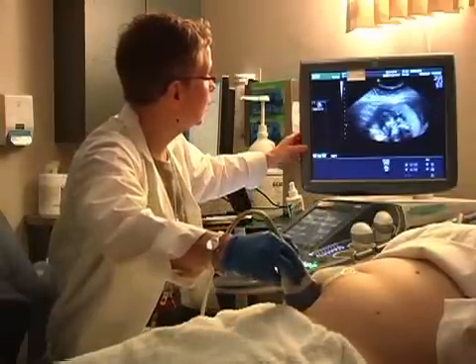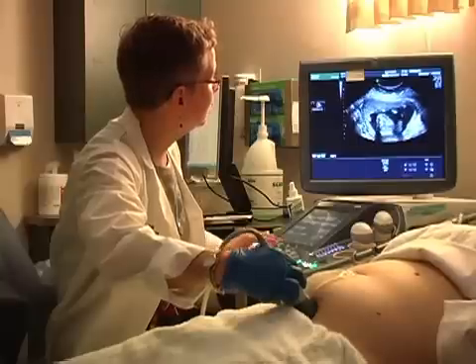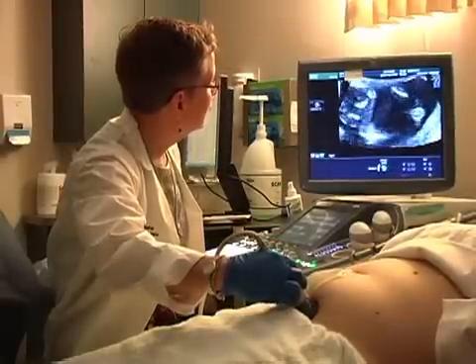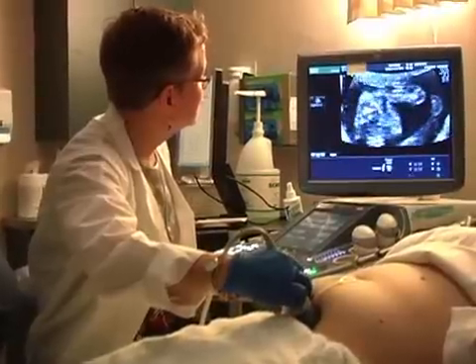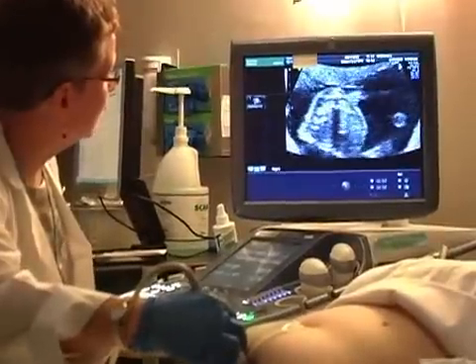That way you're correctly oriented. The first thing I'm going to do is just look and make sure that we've got a heartbeat. If you look right over here, you can see that the baby's heart is beating right here.